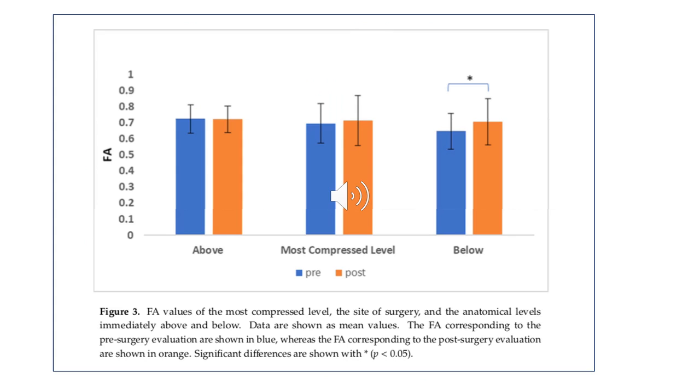This is an interesting finding because we have observed that the main improvement in terms of FA is observed not at the level of the compression or at the most compressed level, but below. In terms of FA, we have an improvement below the level of main compression.